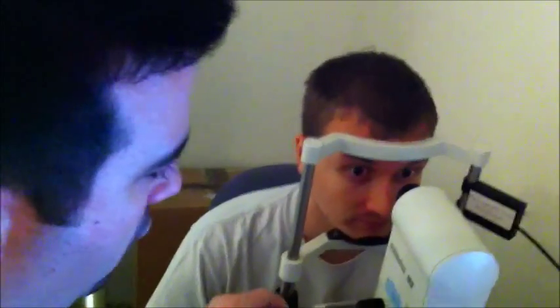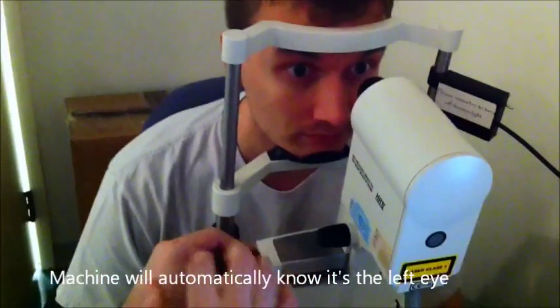We're going to set things up for the left eye, so just pop your chin up there for me. Now when you move it over to the left, the machine will automatically gear for the left eye. So you're doing your fine controls here, and we hop back in here — the machine asks if you want to test the patient again, you just click on OK.